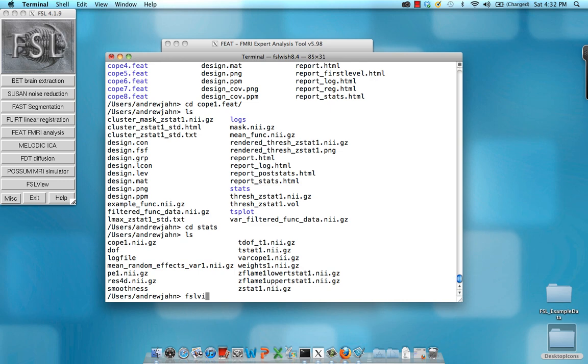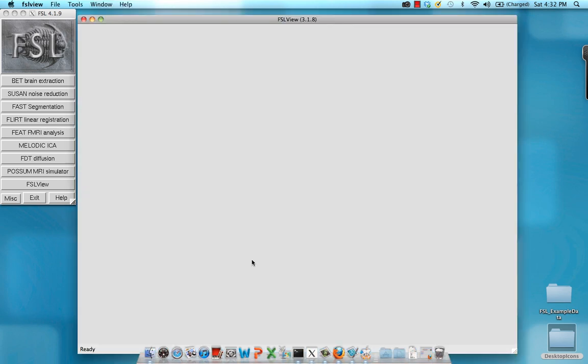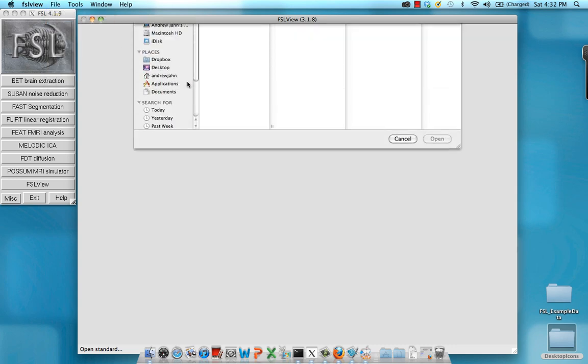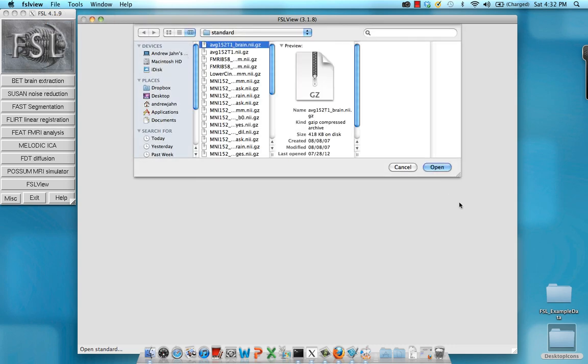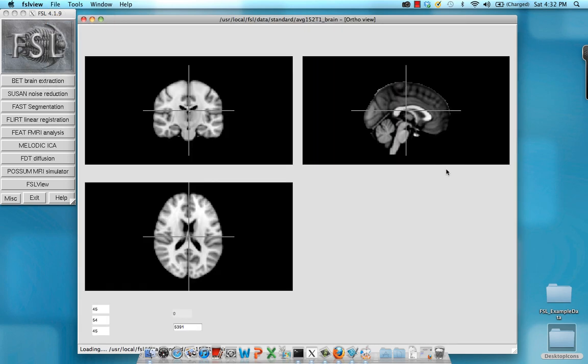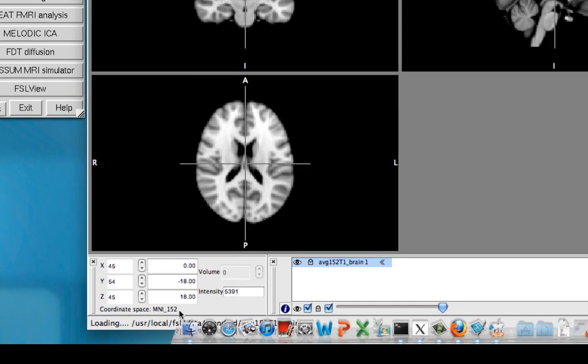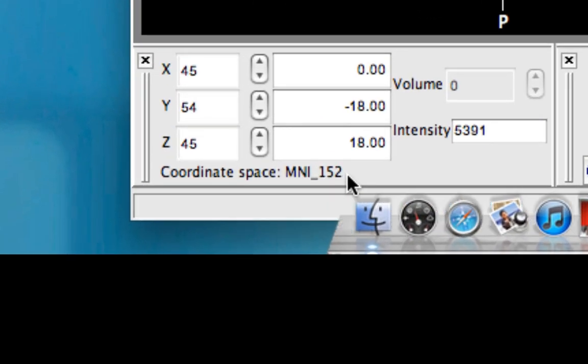So within here, again, I'm going to open up FSL View. And now, the first thing I can do is select File and open up a standard template. This is something that's already in MNI space. If you look down here, you can actually see what space it's in. Here it's MNI. If it were in the original anatomical space, it would say anatomical.